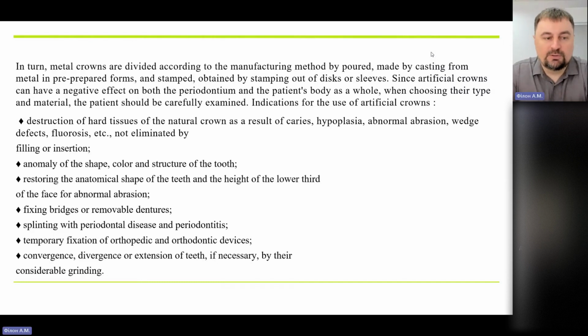After doing the photo protocol, you have to send all those photos to your laboratory and give your technician all the information about the patient, and it's going to help him make a good form, a good type and shape of the teeth. And as I said, when talking about prosthetics for molars, premolars, and the frontal group of teeth, you have to check the bite of the patient before, and understand what kind of shape should be normal in the situation.